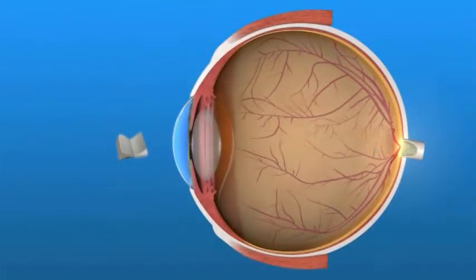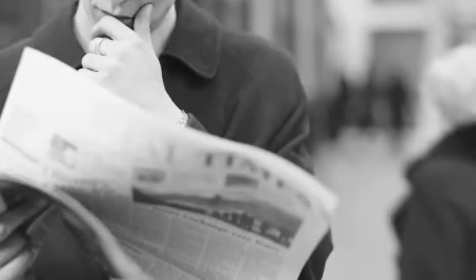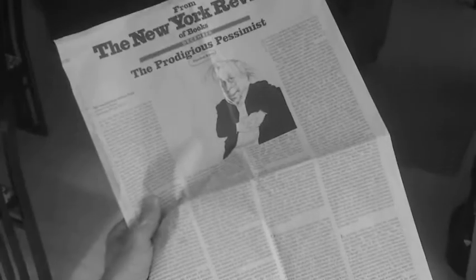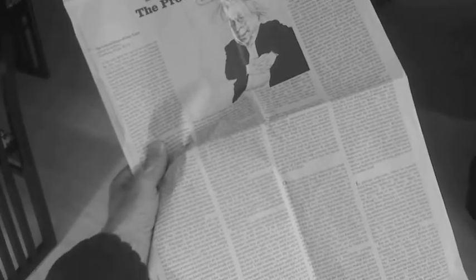As we age, our lens becomes less flexible and resists changing shape, so our ability to see up close is diminished. Usually, the first sign of presbyopia is the need to hold a newspaper or other reading material at arm's length to be able to read them. If you choose to have a traditional monofocal lens implanted after cataract surgery, you can expect to see well at all distances when you're wearing the appropriate glasses.